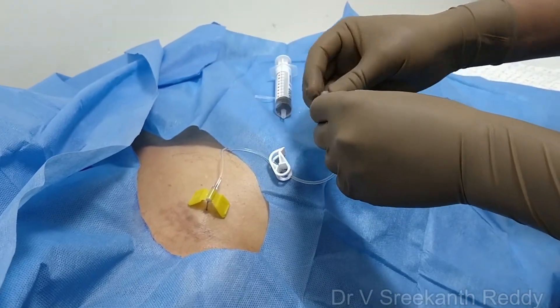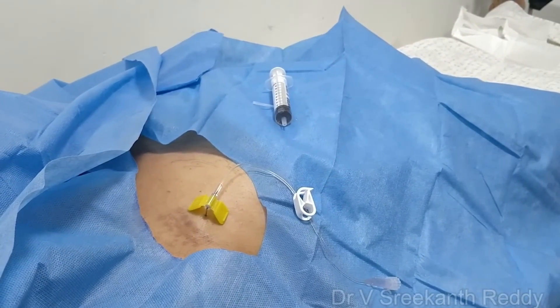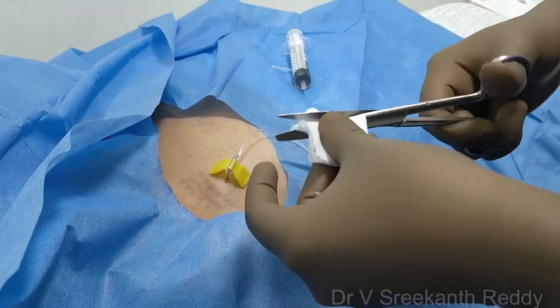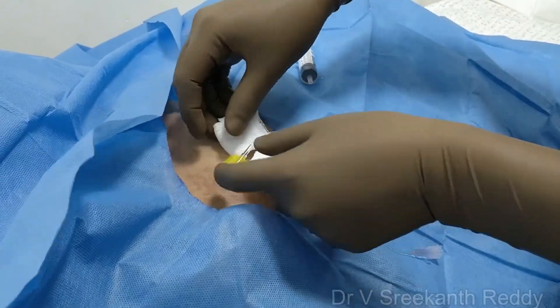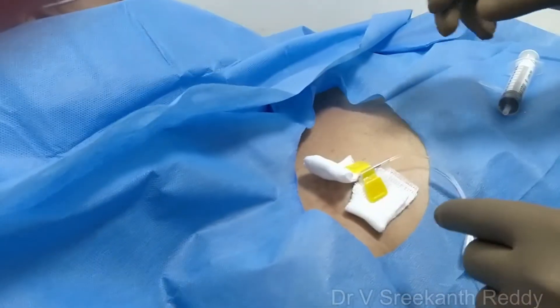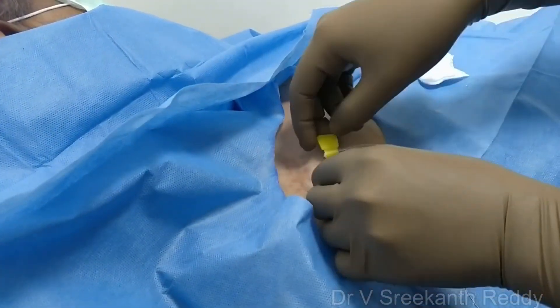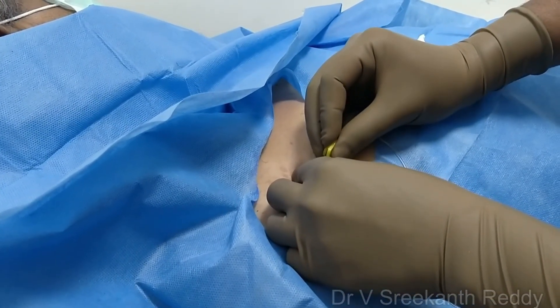If the patient is undergoing chemotherapy, apply a plaster over the Huber needle and leave it for the chemotherapy procedure. If the patient is not undergoing any chemotherapy procedure, then you can remove it. While removing, many people make the mistake of just pulling off the needle, which can displace the port. So you should be very cautious. Before removing, stabilize the port once again with your thumb and index finger, and with the other hand gently pull out the needle.